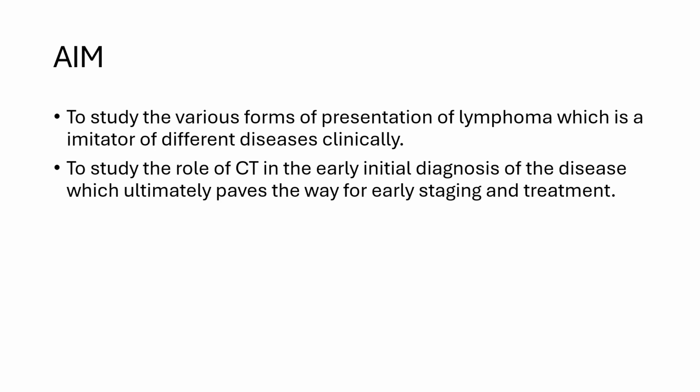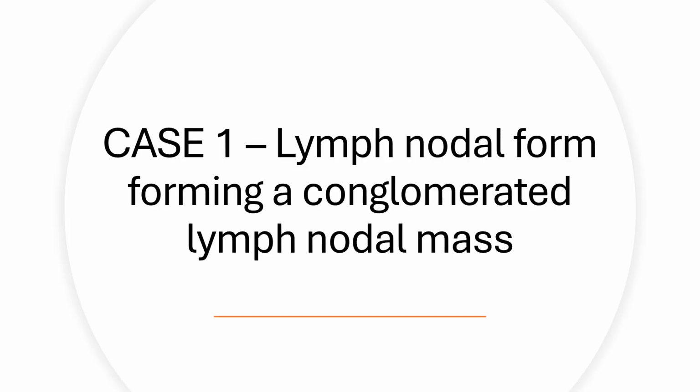The aim of this paper is to study the various forms of presentation of lymphoma, which is the imitator of different diseases clinically, and to study the role of CT in the early initial diagnosis of disease, which ultimately paves the way for early staging and treatment. So we are going to study a variety of cases and the role of different imaging modalities in this.